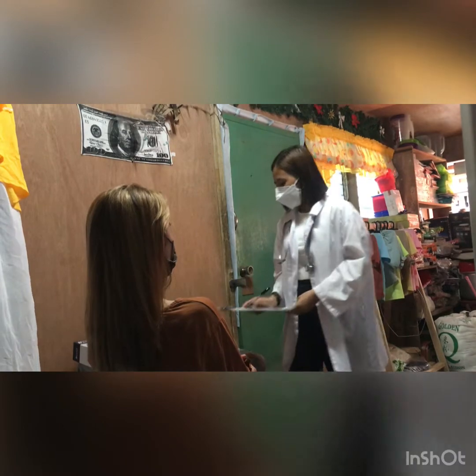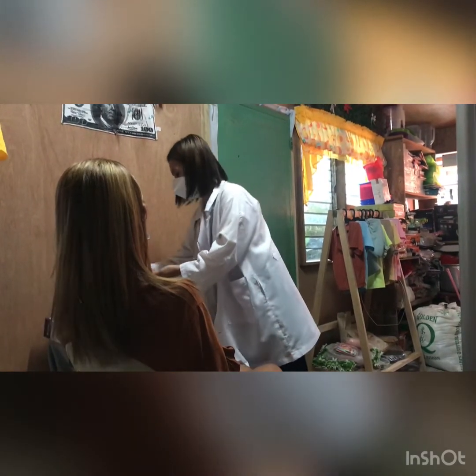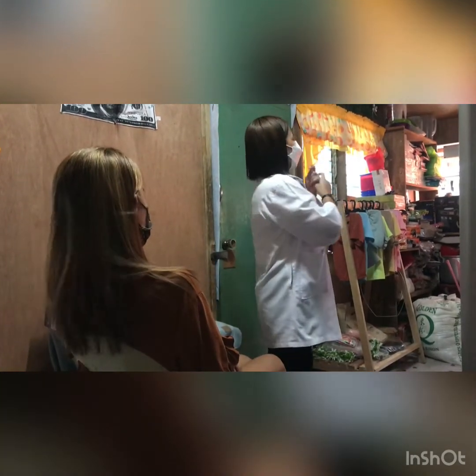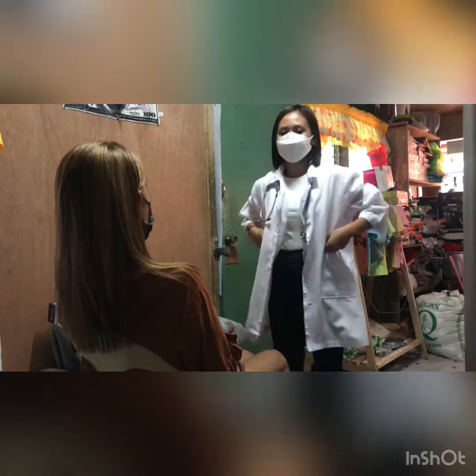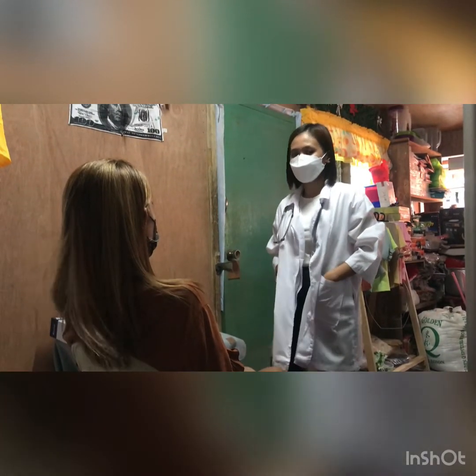So, first is to sanitize your hands to prevent cross-contamination. Then, close the curtains for the privacy of the patient or the client. And then, alright, so I'll be taking your vital signs today, ma'am.